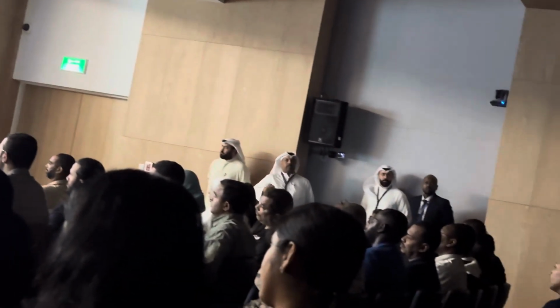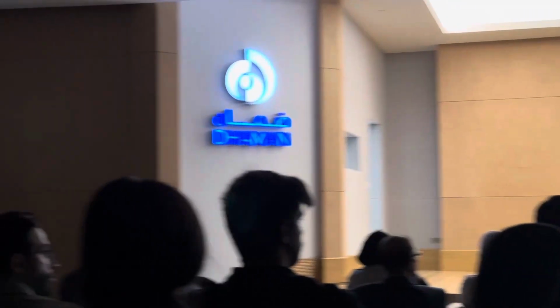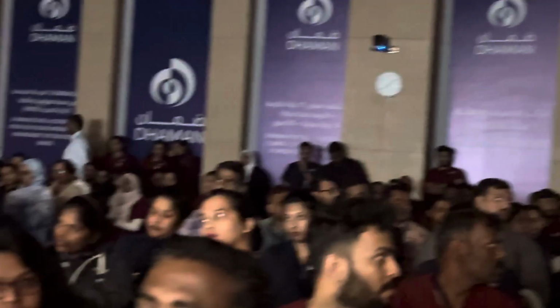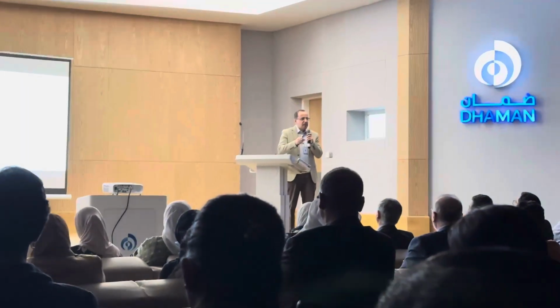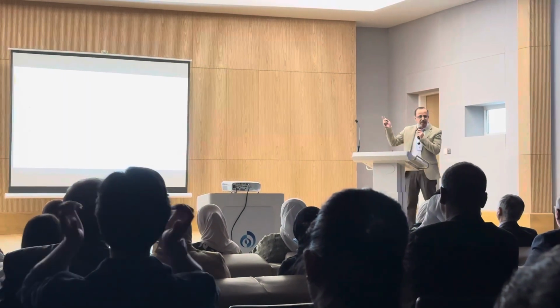All this process is immersed in the very freezing liquid helium that you hear about, and the temperature that makes this material a superconductor is negative 269 centigrade. Imagine how much coldness it takes to reach this level. And this assembly together is installed in a vacuum-sealed enclosure which is around the table of the patient, as we see in the previous image.